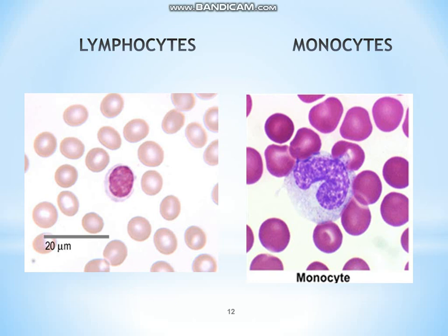Whereas lymphocytes have a nucleus which is mostly very large, sometimes filling all the space of the cell, and only a line of cytoplasm is visible on one side of the nucleus. Their count is 20 to 30% and they are markedly increased due to chronic infections such as syphilis, hepatitis, pernicious anemia and chronic influenza.